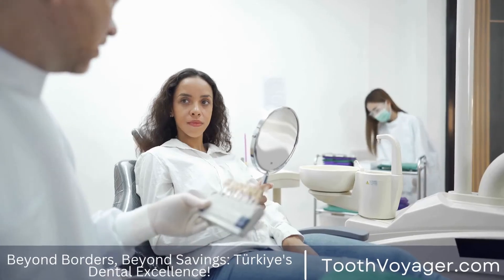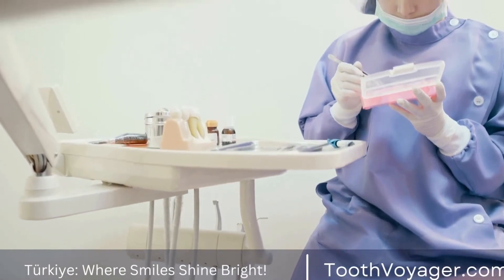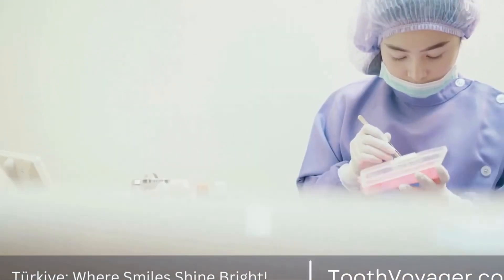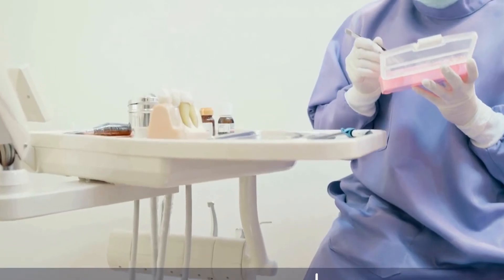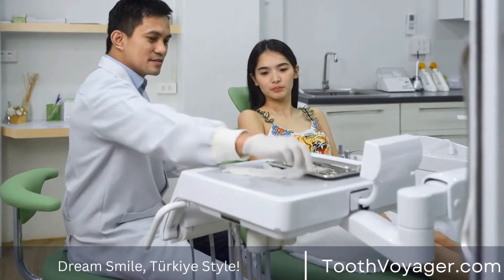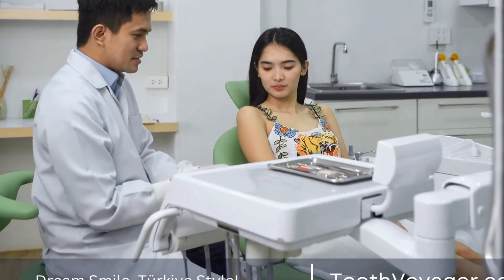Step 4: Filling the Tooth. Once the tooth has been cleaned and disinfected, it will be filled with a rubber-like material called gutta percha to seal the root canals and prevent any further infection. The tooth will then be sealed with a temporary filling to protect it until the permanent crown can be placed.